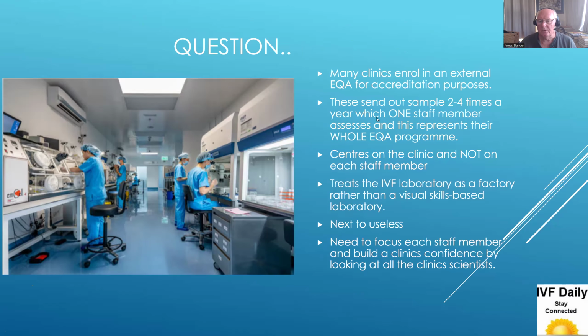So many clinics do enroll in an external EQA program for accreditation purposes. And many of these, they all vary, and I'm not that particularly interested in all the other ones. They've all been around for a long time, but they usually send out a small number of samples each year, which one staff member should theoretically assess, and this represents their whole EQA program.